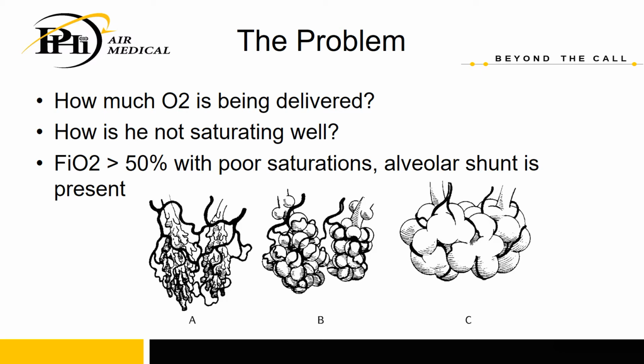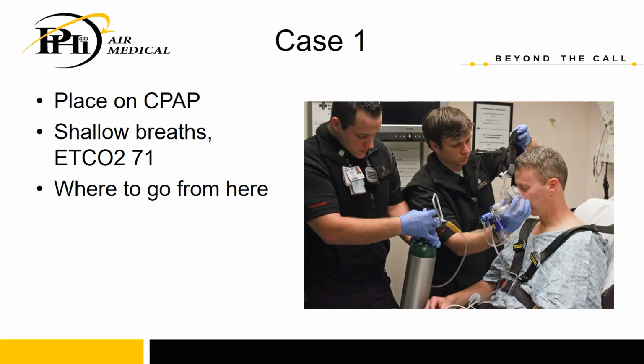We combine those two by putting our patient on CPAP, right? We have a constant or a continuous flow of oxygen at or nearing 100% FiO2 generally, and we are going to be keeping pressure in the system by adding 5 or 10 of PEEP, and we now have CPAP. Unfortunately, we're only treating the oxygenation side, right? We're not going to force this person to take way larger breaths with CPAP.